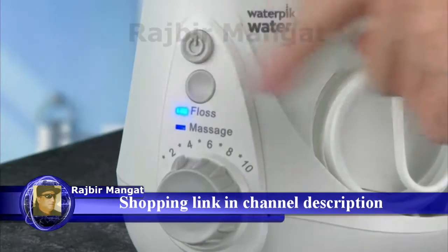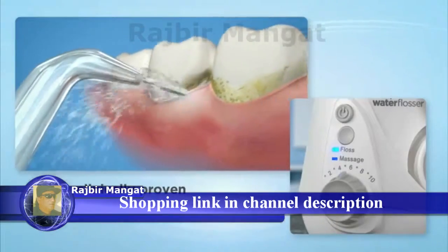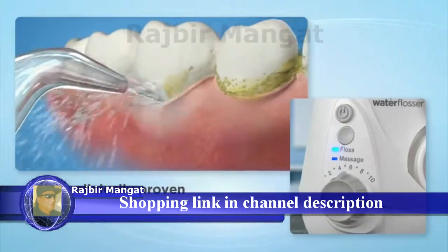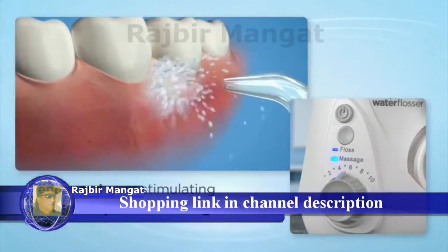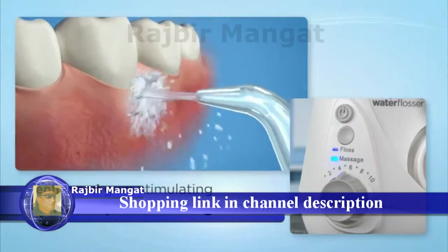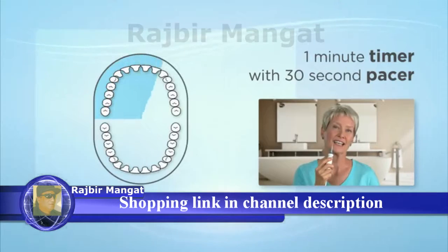Two water flossing modes: floss for the ultimate in interdental cleaning, and new hydropulse massage for enhanced gum stimulation and circulation, plus a one-minute timer and 30-second pacer to ensure thorough cleaning.